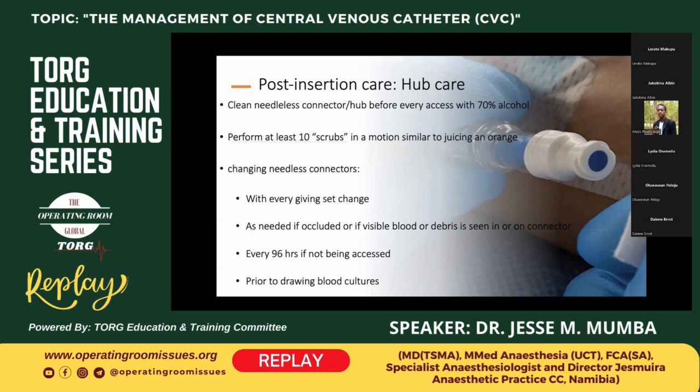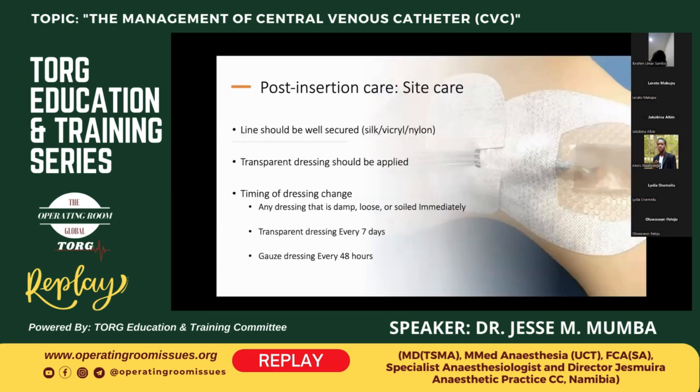And also, I must mention here that if you are going to use total parenteral nutrition, you need to have a dedicated line. So if it's a 3 lumen CVP, one line is simply dedicated to TPN, and you never disconnect it unless you are changing the whole TPN bag. And when changing the TPN bag, the recommendation is that you should don your full sterile equipment.